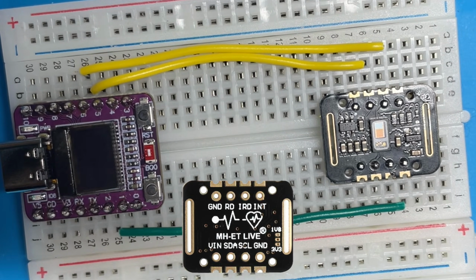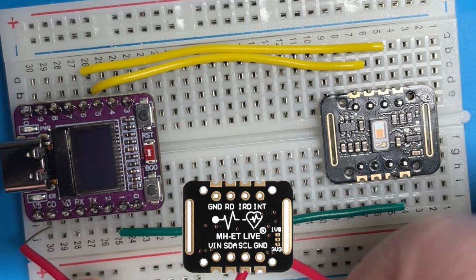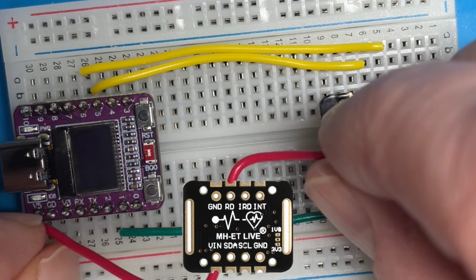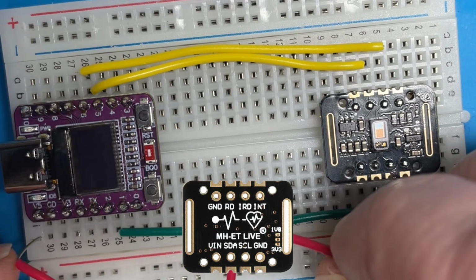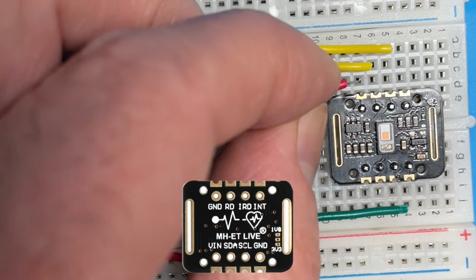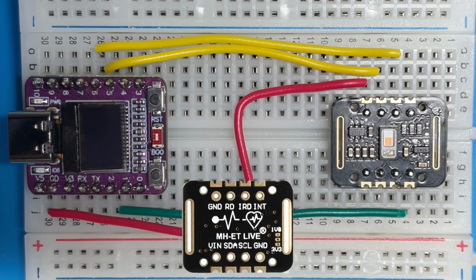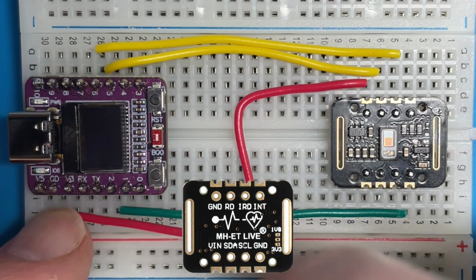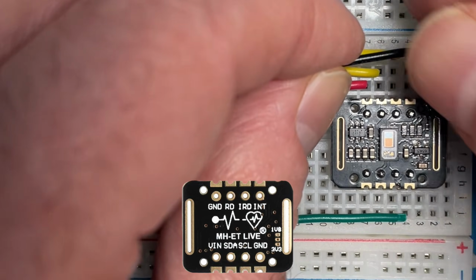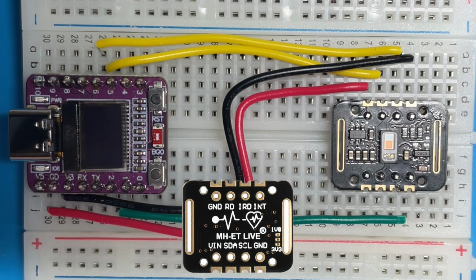And then we just need power and ground. So I'll power it off 5 volts because it's got a 3.3 volt regulator. So we can connect V5. If I can get that in, V5, and this one there, that's V in. And then of course we need ground, so connect ground. That goes to this top one. So that should be all the wiring we actually need.